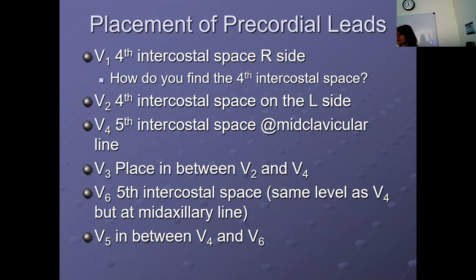There are also cultural situations you might be in. If somebody's in a burqa or something like that, as a man, you're probably not going to do that EKG. But generally, older women don't care. They'll just pull them out. For younger women or anything like that, I generally try to run it by them. 9 times out of 10, let's see, go ahead.